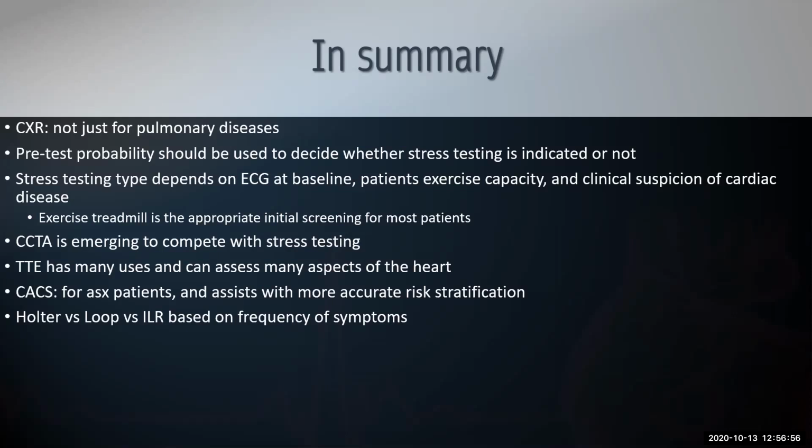And we briefly went over transthoracic echocardiograms, but I urge you to look at Dr. Duffy's discussion because he went into more detail about that, because it gives us more information about the heart. And as he likes to say as well, it's kind of replacing the stethoscope as an immediate option that we can do at the bedside of getting more information than the stethoscope can provide.